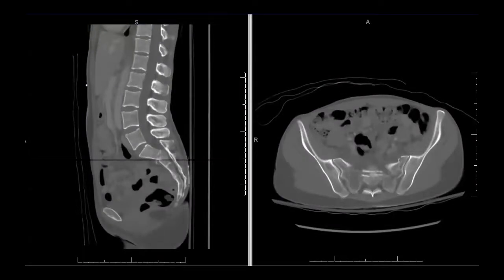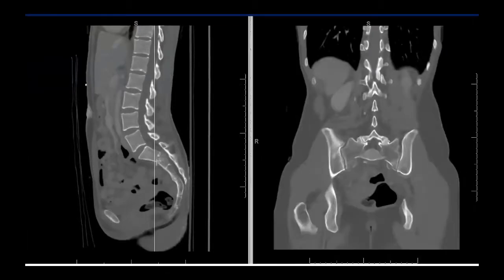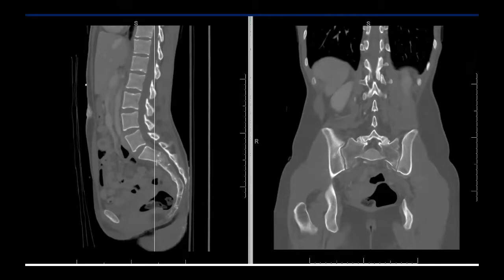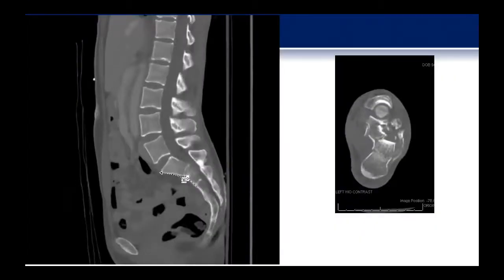This is her CT scan. You can see that she has a sacral fracture with some kyphosis. It's a U-type fracture. Unfortunately, they don't have cuts in the plane of the sacrum, so you don't really have a good CT cut representing an outlet view, which would be most helpful in assessing fracture morphology. It appears to be a U-type fracture with fractures through the sacral ala and a transverse fracture through the body between S1 and S2, with about 36 degrees of kyphosis at the fracture site. She also has a severely comminuted calcaneus fracture on the left side.